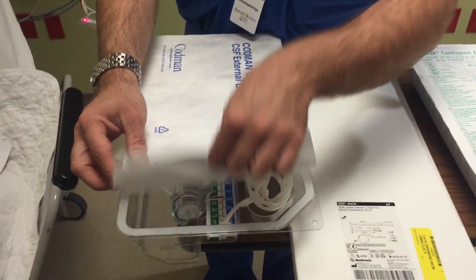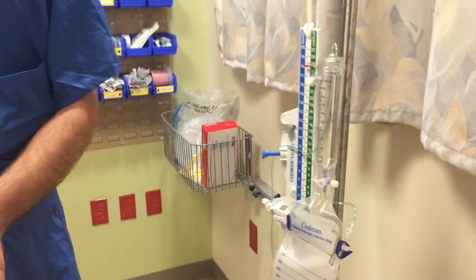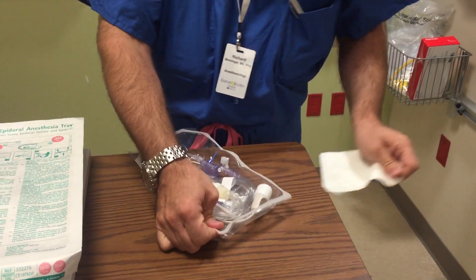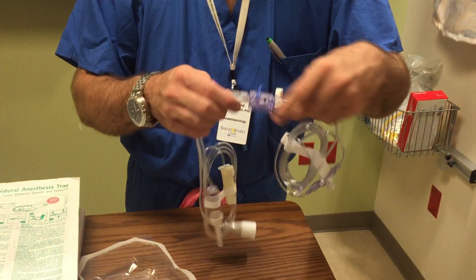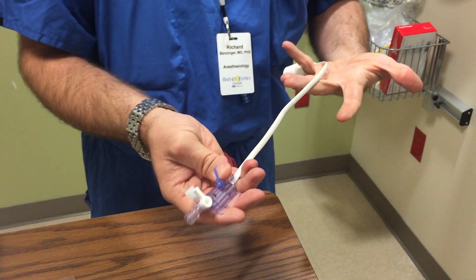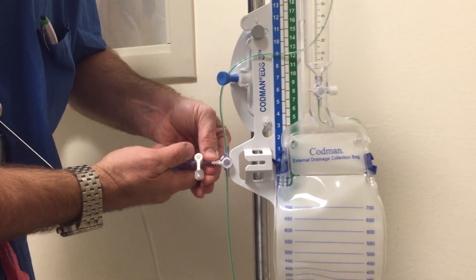You can set up the drainage reservoir either before or after you place the drain, just depending on urgency. The drainage system needs to be primed with sterile saline before it's connected to a patient in order to have CSF drain properly. We start by taking our single transducer and disconnecting all of the tubing from it. All that we need is the transducer itself and its electrical connection. We connect that transducer to the three-way stopcock on the drainage system.